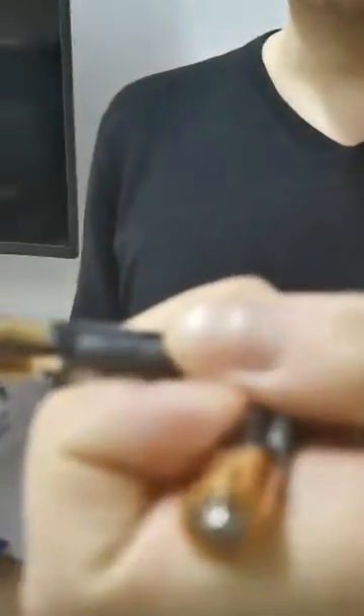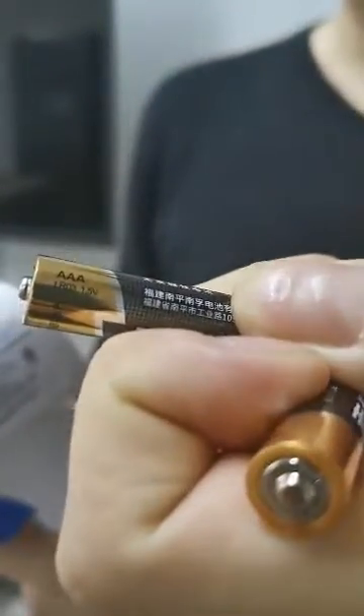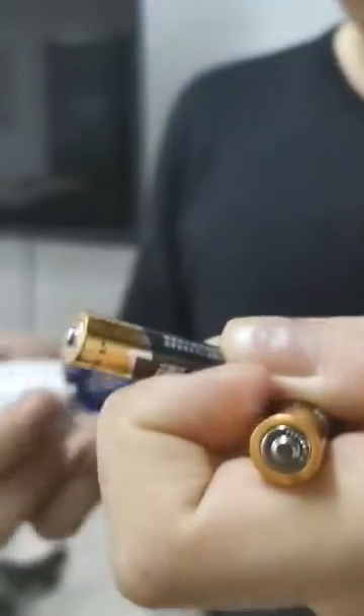We have done the quality check and the setup before we ship it out, so it should be quite easy for you to use it. First of all, we should have two AAA batteries. Here is a AAA battery, and we should install the batteries correctly into the thermometer.